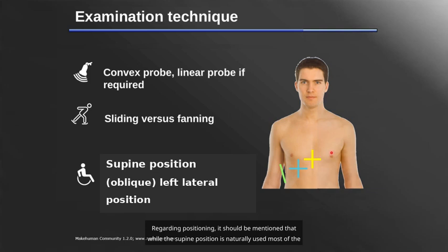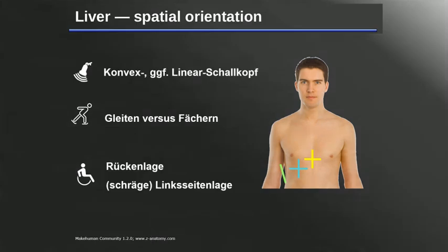Regarding positioning, it should be mentioned that while the supine position is naturally used most of the time, here too, since we also have the bile ducts as part of the liver, the oblique left lateral position is definitely helpful and should be used whenever possible.